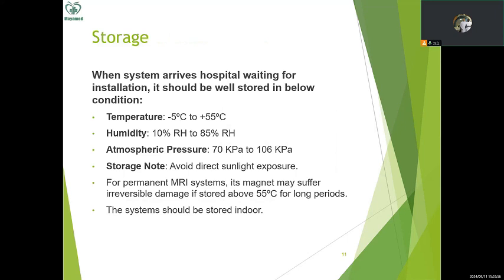The temperature is -5 to +55 degrees centigrade. The humidity is 10% to 85%. The atmospheric pressure is approximately 70 kPa to 106 kPa.